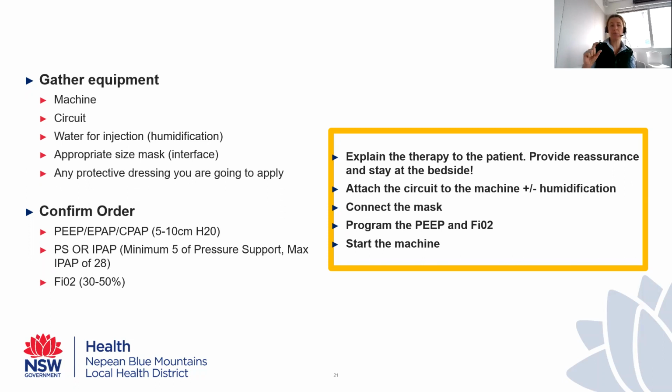The reason being is because when we're getting to pressures that high, we start running the risk of actually causing damage to the lungs. We can't just keep blowing up the lungs more and more. It is going to cause damage and issues. It is very uncomfortable for the patients, and it can cause hemodynamic effects.